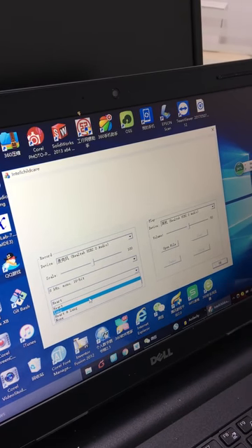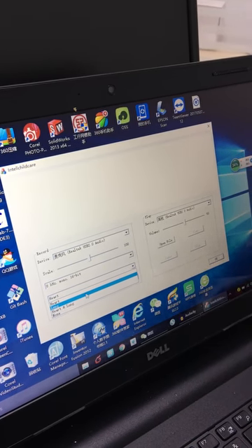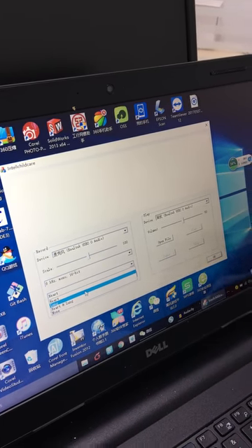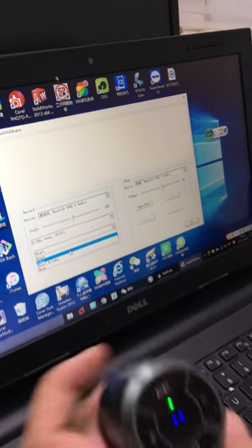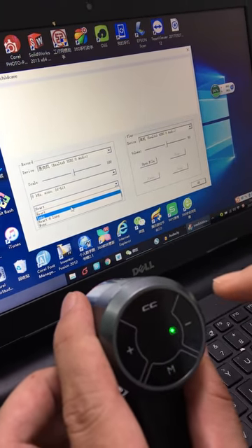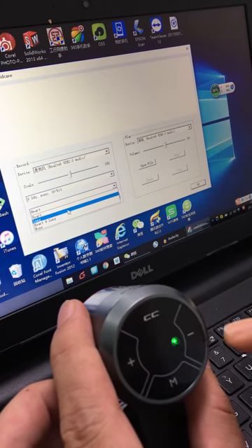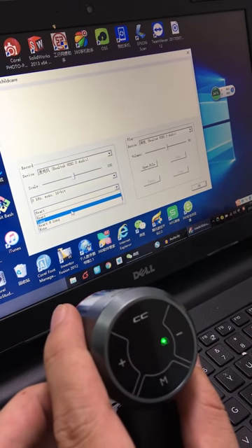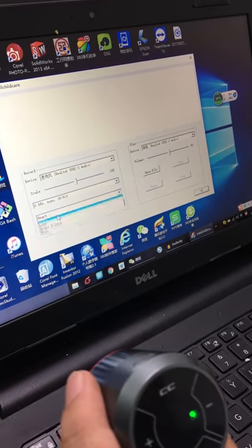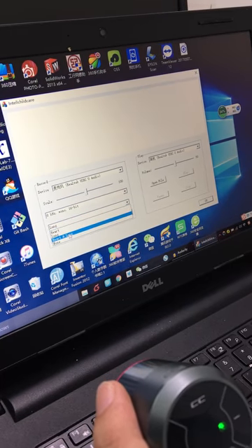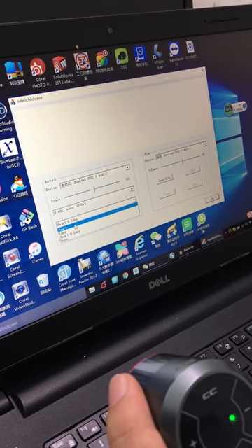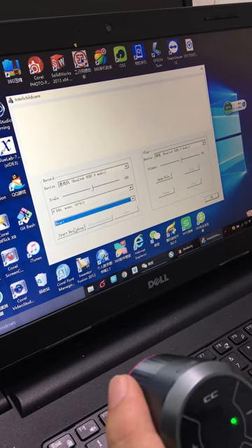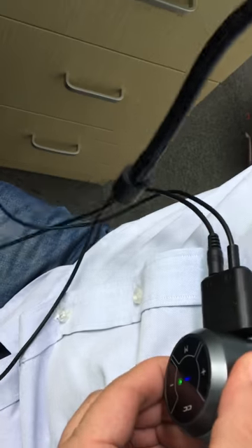But when you use this mode from software, you must change the mode on hardware to the third mode. Then, we can select heart, lung, or heart and lung. We can select heart. Also, we put it on myself.